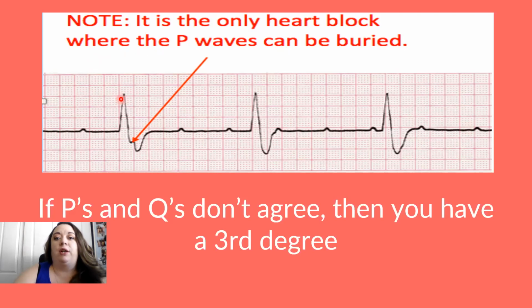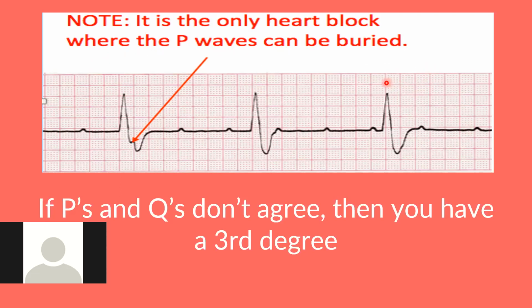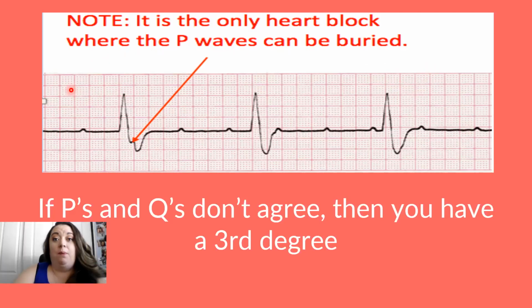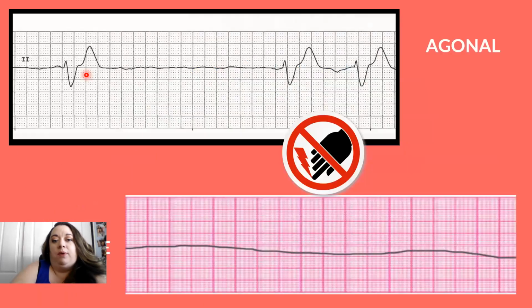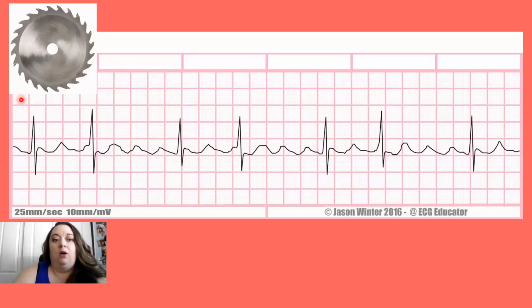So what's your ventricular rate here? 30. 30, yeah. So when you have a complete heart block, whenever we check a rate on a rhythm, we always go by QRS complexes, right? So if I said, hey, what's this one? 1, 2, 3, 4, 5, 6, 7. 7 times 10 is 70.